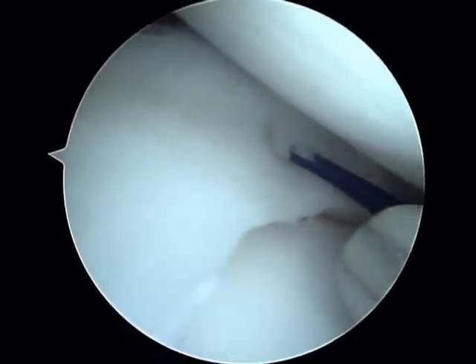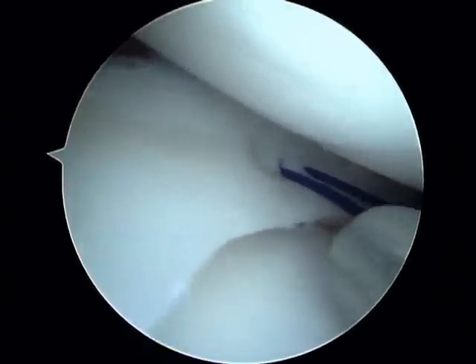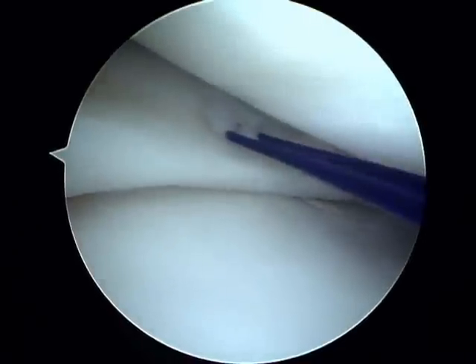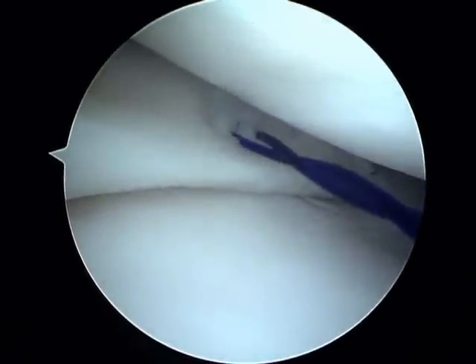After it is reduced, sutures are placed from inside the knee towards the capsule of the knee. Multiple sutures are used to repair the meniscus, and this is the suture being pulled into position securing the cartilage to the capsule.